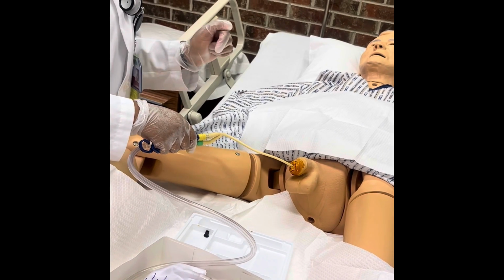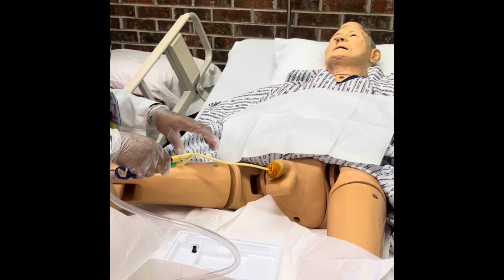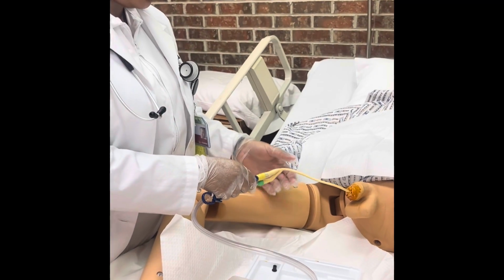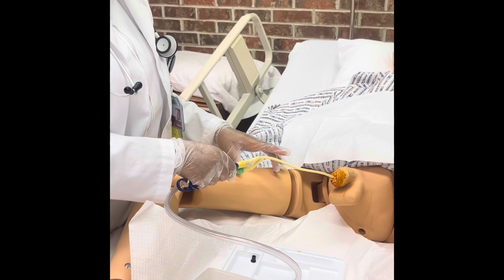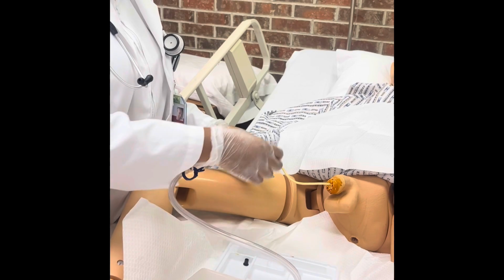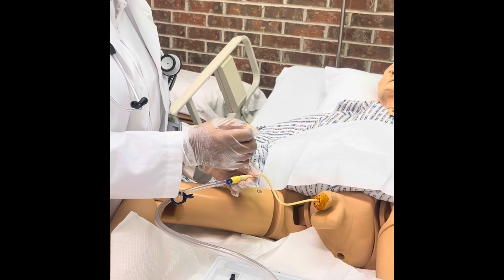this kit doesn't come with it, but it would come with the sticker to attach the catheter to the thigh. To do that, you will go ahead and attach the sticker to the catheter. Find a good placement for where you want to have it on his thigh, because when you attach it, you want to give some pull room.